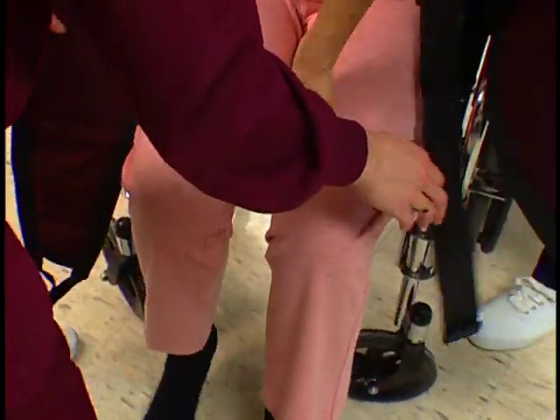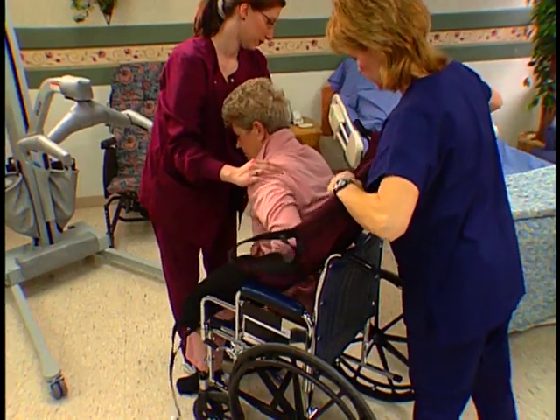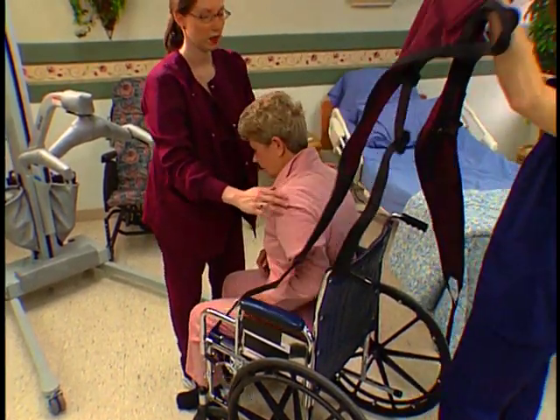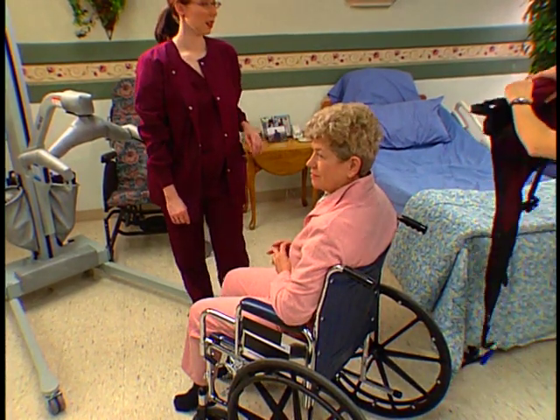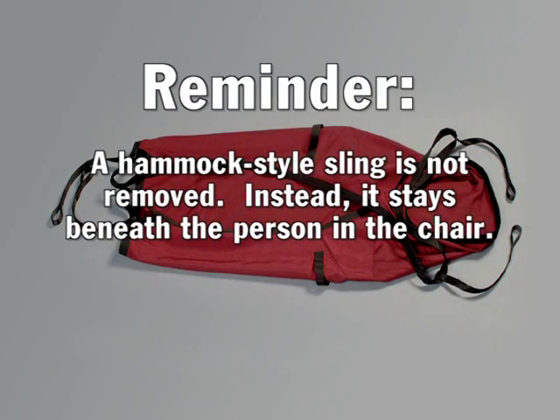Do the same with the other leg and pull out the sling material between the side of the chair frame and the resident. Lean the person forward and gently pull the sling material out from between the resident's back and the chair. Reminder: a hammock-style sling is not removed. Instead, it stays beneath the person in the chair.